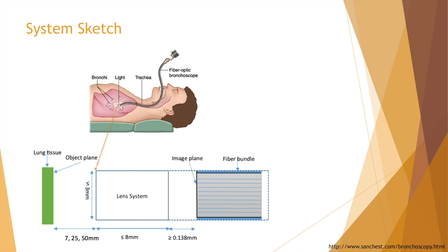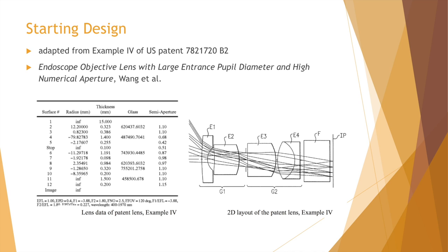At the conventional imaging plane, the fibers relay the image to the other end of the fiber and register the image onto an eyepiece or a digital screen. The objective design is performed with ray-tracing software Code5. We adopt one of the examples from a patent as our starting design. The objective lens has five elements in total: one positive group and one negative lens group. The aperture stop is placed in between these two groups.